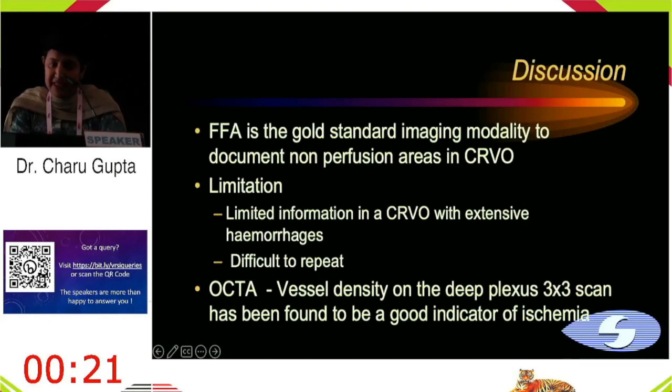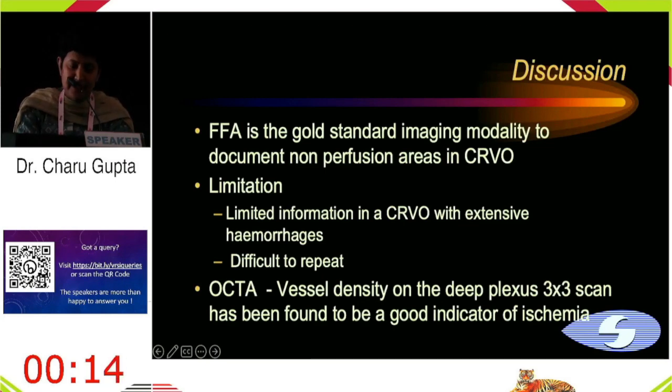So FFA is definitely the gold standard imaging modality to document non-perfusion areas in CRVO. Limitations, of course, are that when there are extensive hemorrhages, it is difficult to interpret, and it's very difficult to repeat in some of these patients.